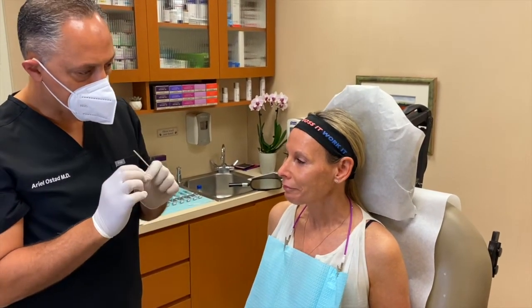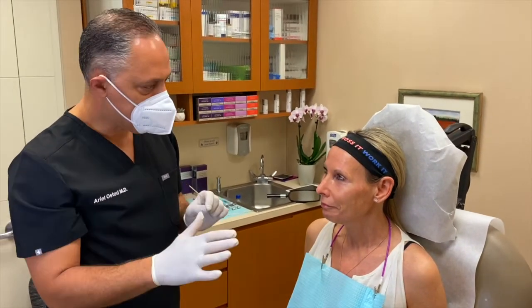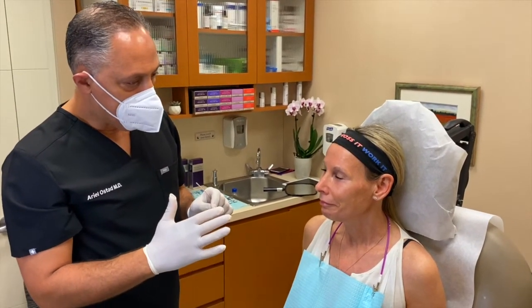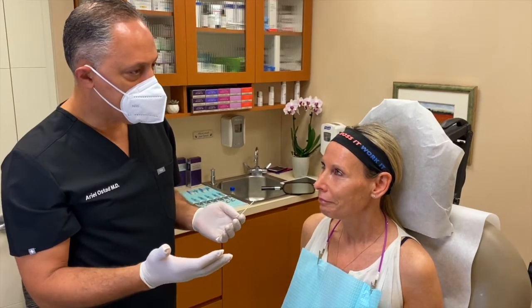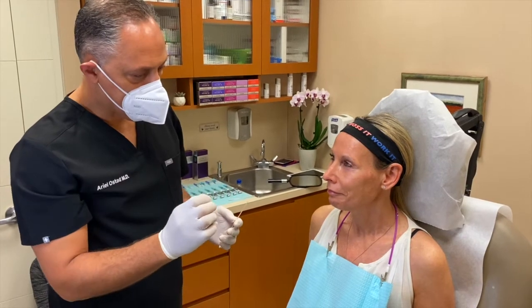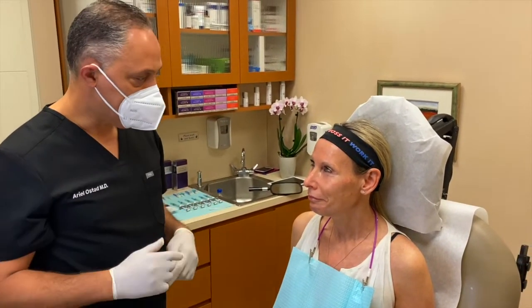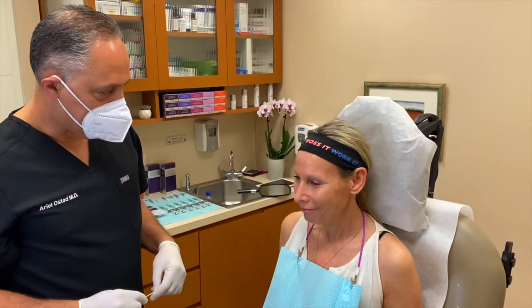With the cannula, we can insert it below your skin, and I have the flexibility of maneuvering and moving it. With that, we can create a beautiful result with really minimal issues with needle marks. You can walk out of here, put on a little bit of makeup, and be presentable and go out for lunch if you wanted to. So let's get started, okay? Great.